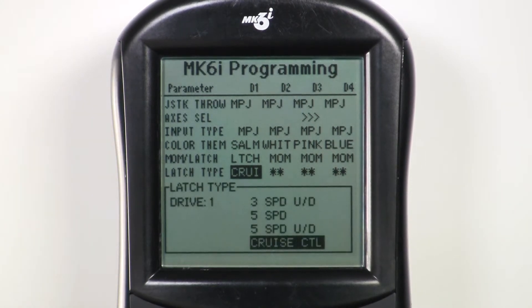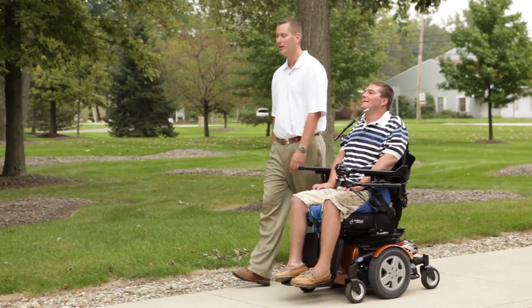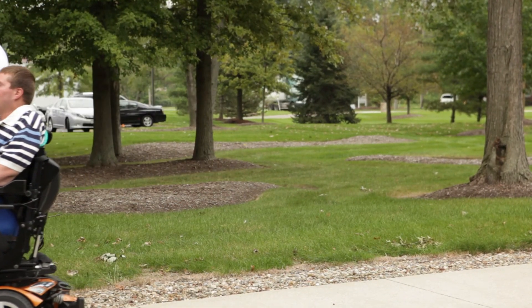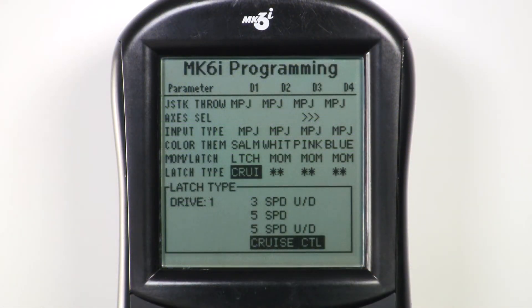In cruise control, the chair slowly ramps up speed as the driver sustains or holds down the forward command. When the desired speed is attained, the driver lets go of the forward command and the chair will maintain that speed. Left and right commands remain momentary and are used to keep the chair on course. Ramping down speed is by holding the reverse command. Stopping is through two successive reverse commands or by activating the emergency stop switch.